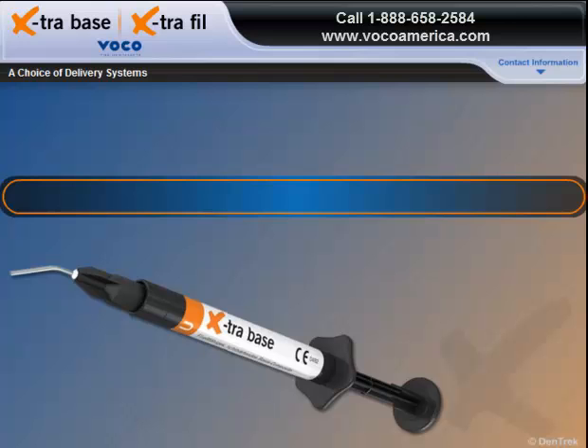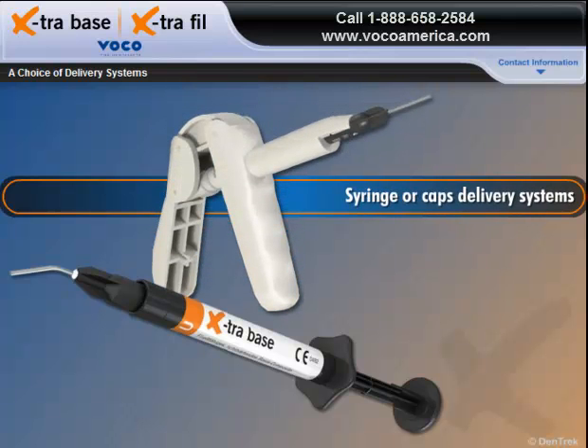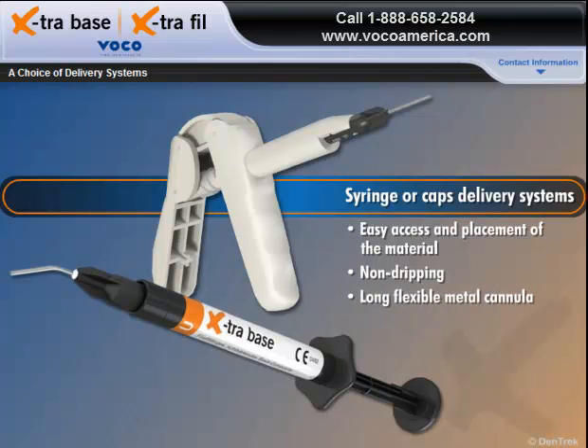With Extra Base, you have a choice of syringe or caps delivery systems that are specially designed to facilitate easy access and placement of the material. The non-dripping syringe and the Unidose caps, each with its long, flexible metal cannula, ensure precise application, even in hard-to-reach areas.